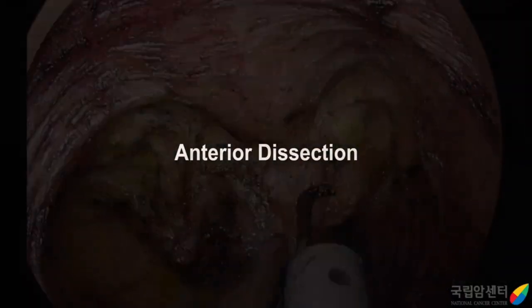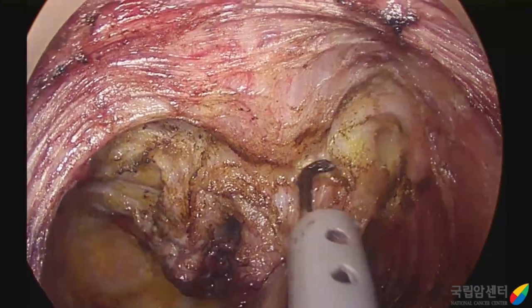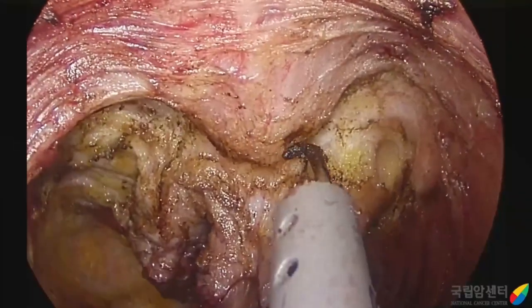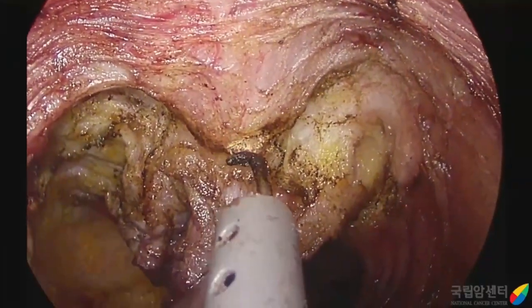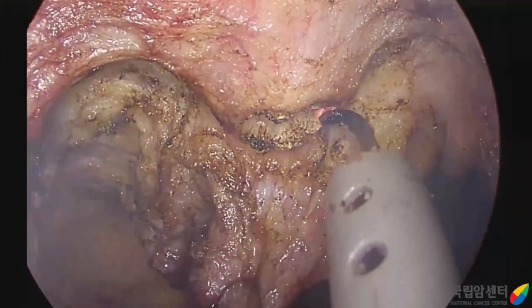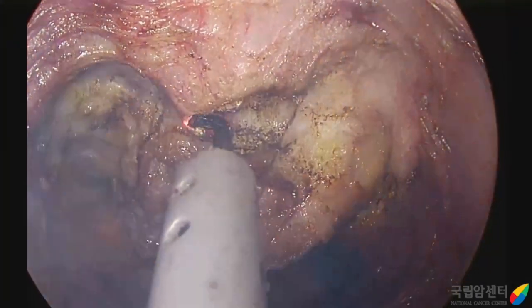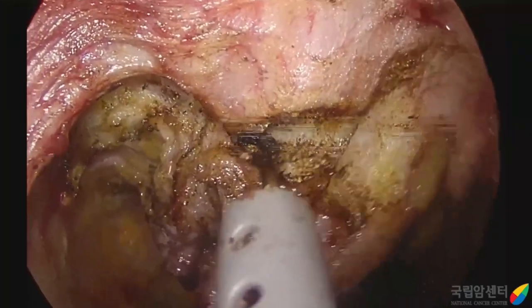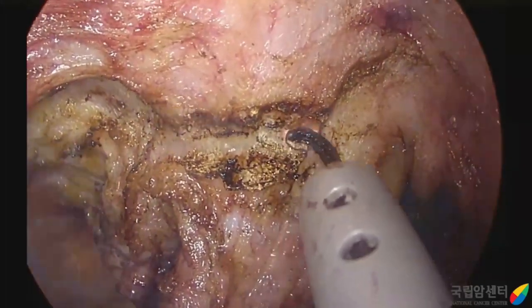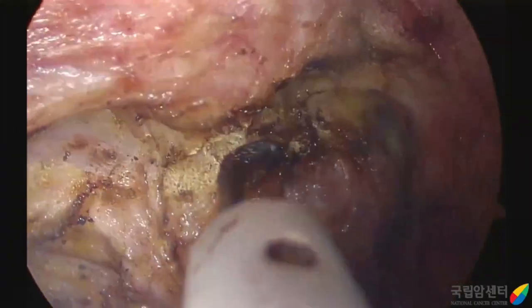When the tumor level is very low and located anteriorly, we should identify the rectourethral muscle. If the anterior dissection plane is too close to the urethral sphincter muscle, we can damage the urethra. Urethral injury during transanal TME happens in 1% of patients, and this complication could result in open conversion and persistent urinary dysfunction. In severe cases, we cannot avoid permanent urinary diversion.